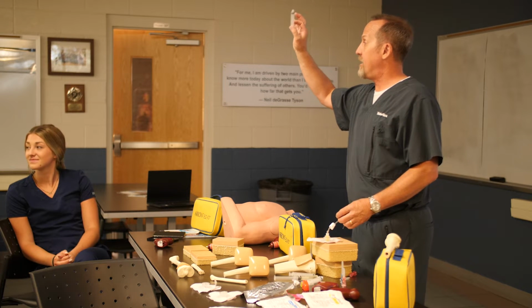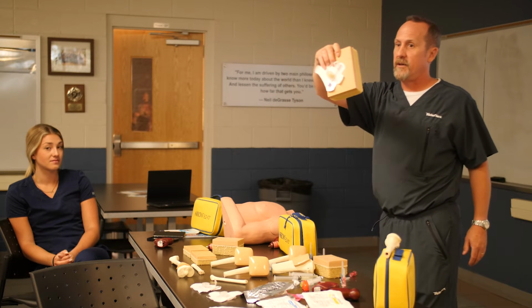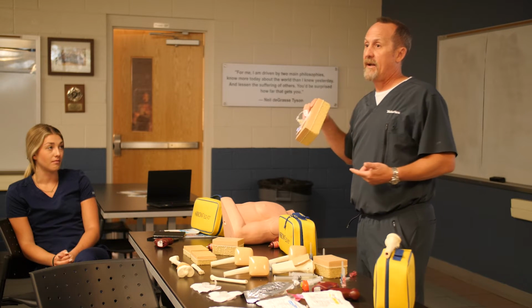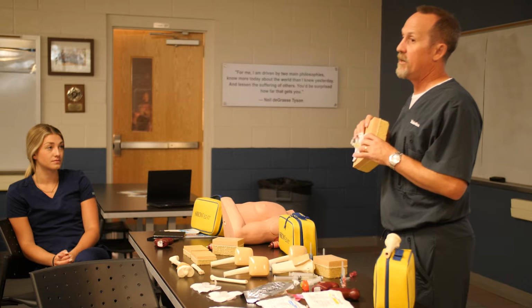So after we've done that, you can take your syringe off, and a lot of people don't know this, but the dressing has a great little clip on there, so you can put your extension set on there. Once this is inserted, this can be used for anything that you would put through a peripheral IV. Okay, same rate, same dosage, all that kind of stuff. Anything you put through your peripheral IV can go through this.